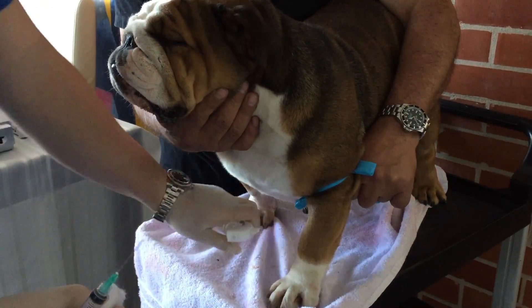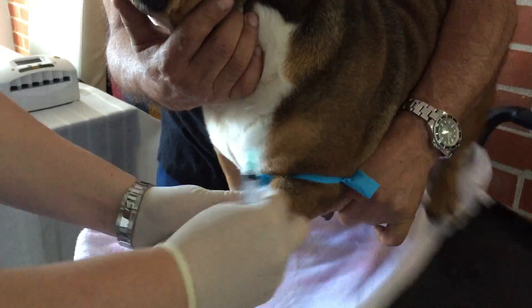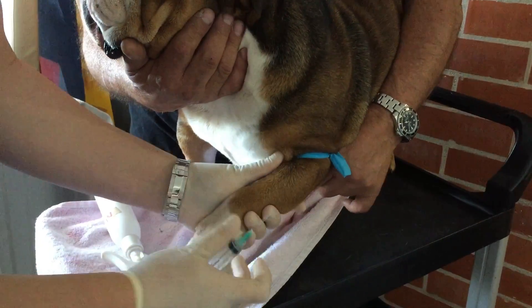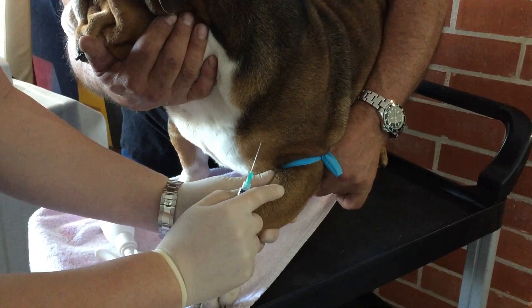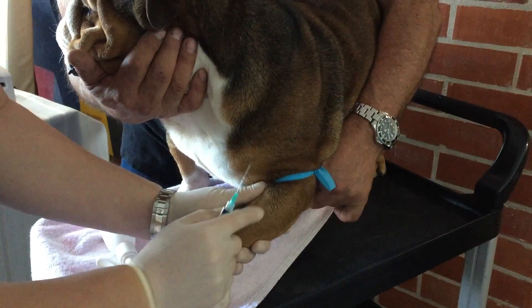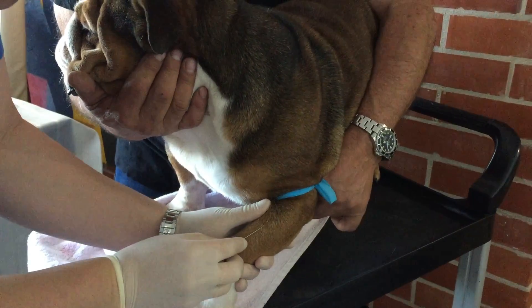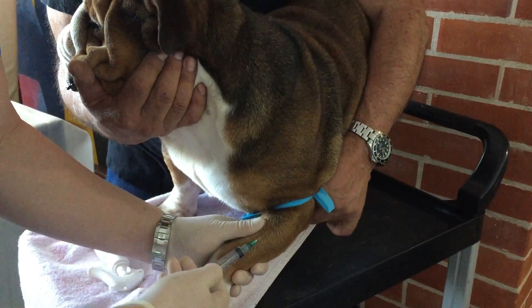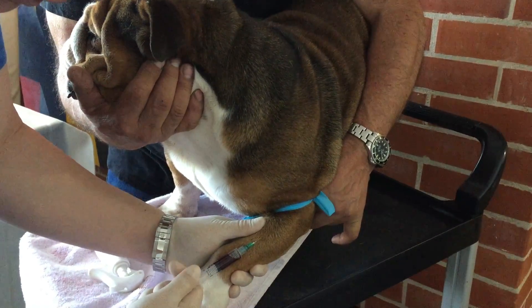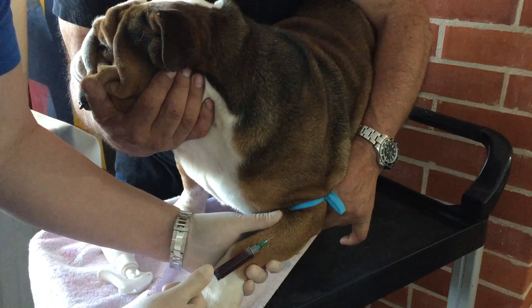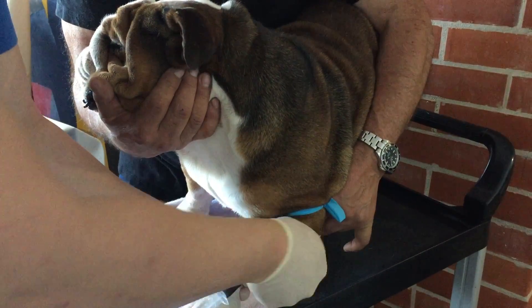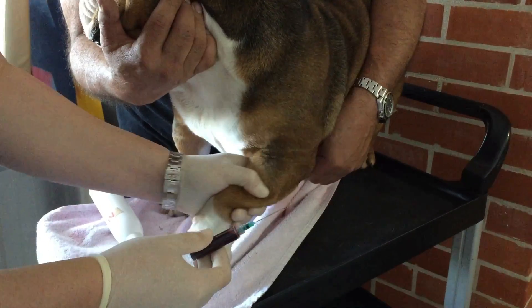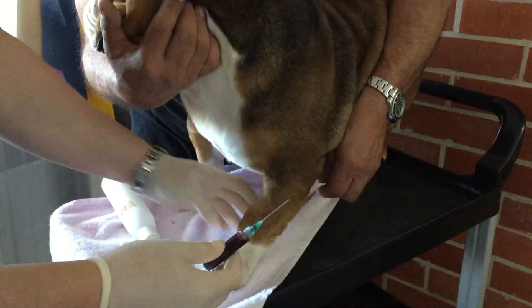Alright, you want the hole facing you and you want to feel the vein. Okay, and all you do, you just press it a little bit until you see blood in the needle. There you go, you see it's right there, and then you just withdraw slowly. And that's it. You don't need to be poking around or pushing it like that. It's right over the vein. Okay, and then you constrict it for a little bit so no blood comes out, and you're done.